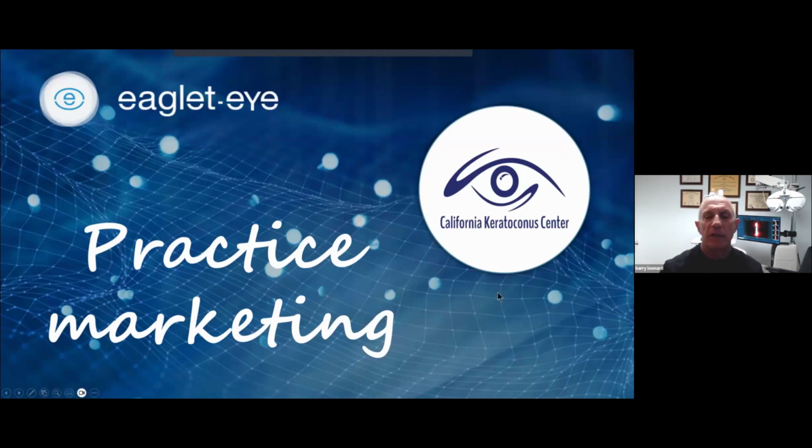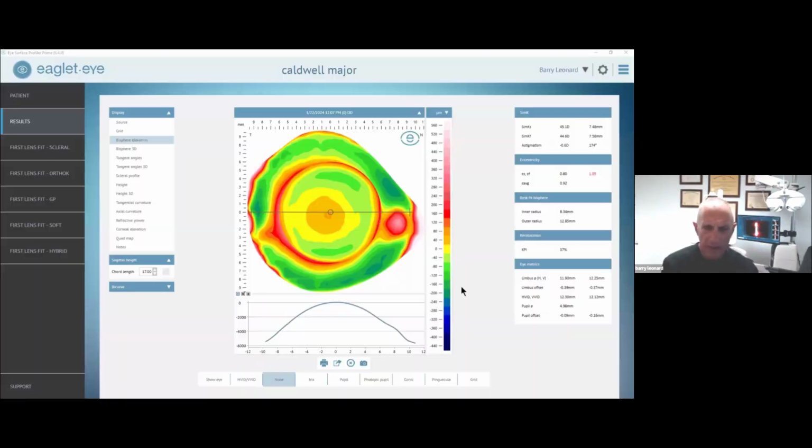It's a little awkward, but it's worthwhile, because when we have a patient in the chair, I have developed something I call the Scleral method. What we all do is a stepwise walk through with a patient. And the first thing every patient in my office gets is topography, because we have our autorefractor, topography, and wavefront all together. There we go. Thank you, Johnny. And I can show them that, and we can say, here is your keratoconus, and you have this and that. And then now it's time to do the eaglet measurements.